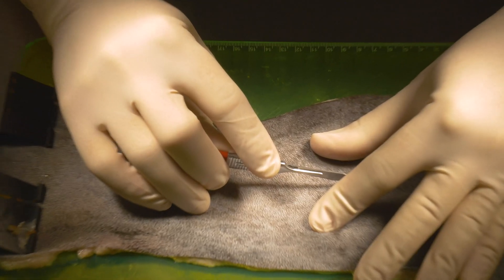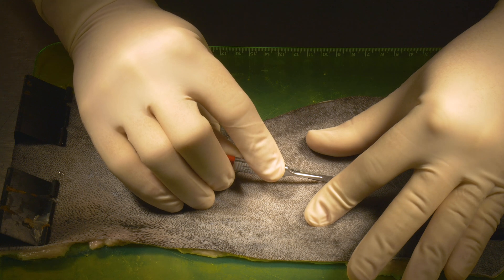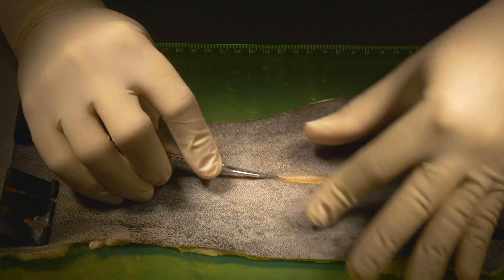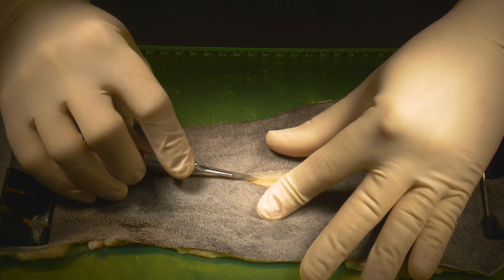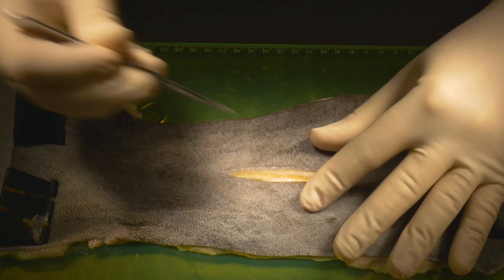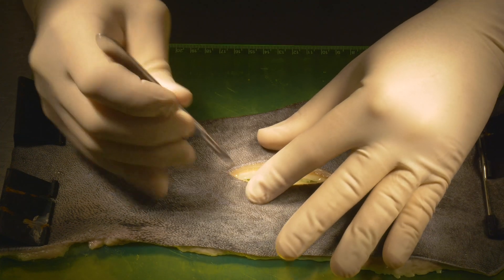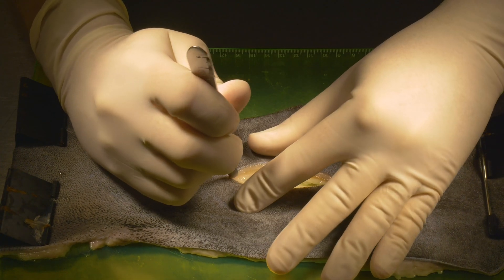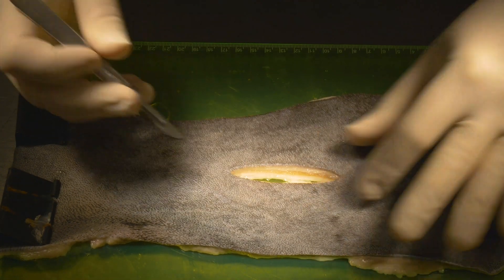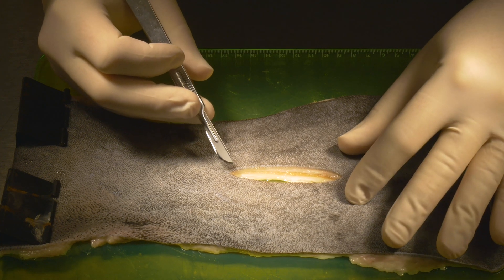With an overhand grip in my dominant hand, I'm going to spread the skin to tense it up with my non-dominant hand and make a nice perpendicular cut. My blade will not come off the skin. My left non-dominant hand will move to keep the tension. Then I switch to a pencil grip to fully make sure my sub-Q is cut, especially at the end, because that's where we need that nice cut tissue so we can bury our knots more effectively.